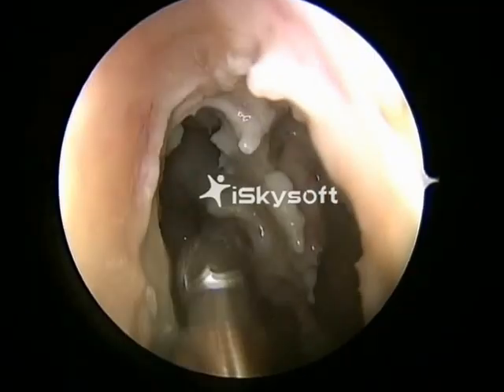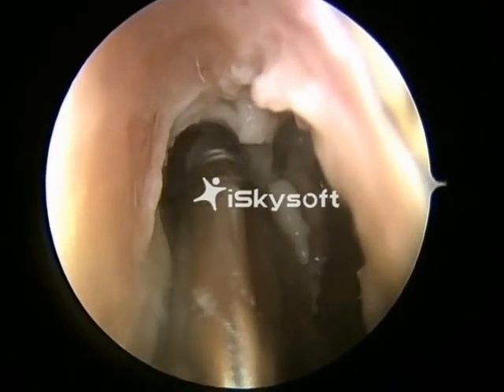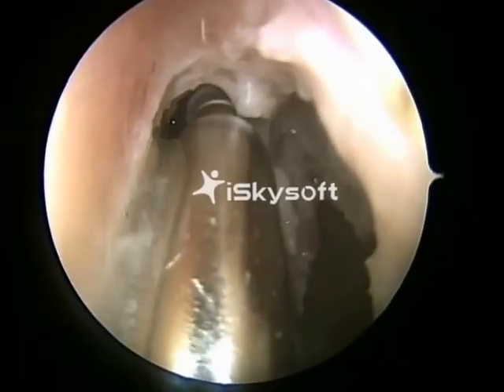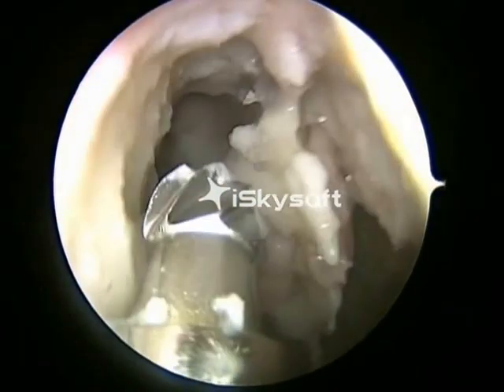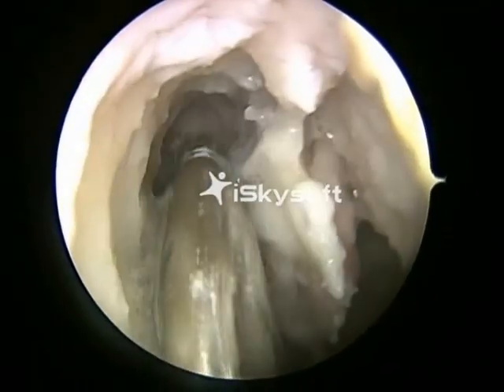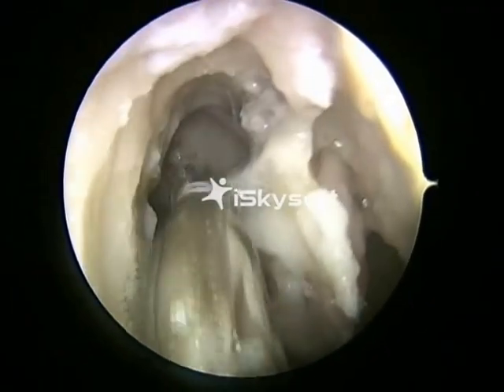The same procedure is done on the other side. And now we are curving medially, as you can see, moving towards the left side.